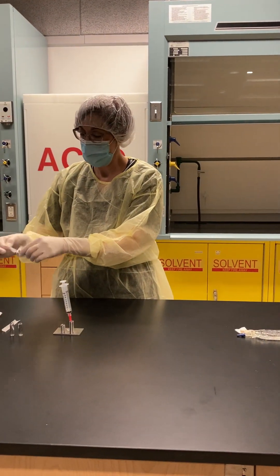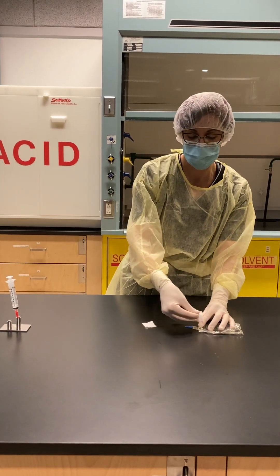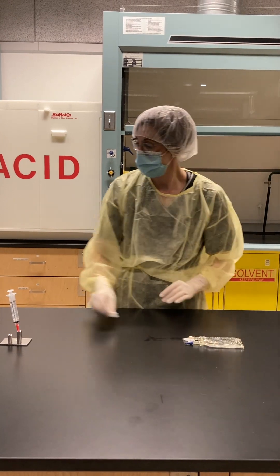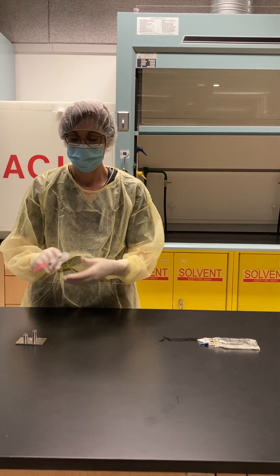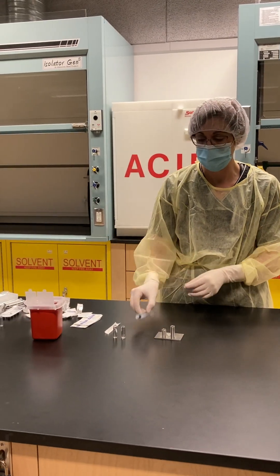I'm going to re-swab my port to maintain sterility. Always discard your sharps in your sharps container.